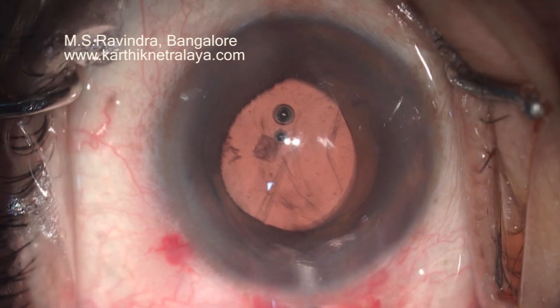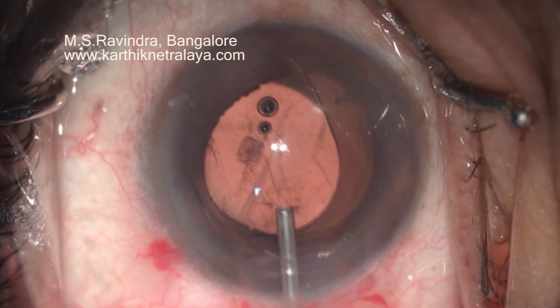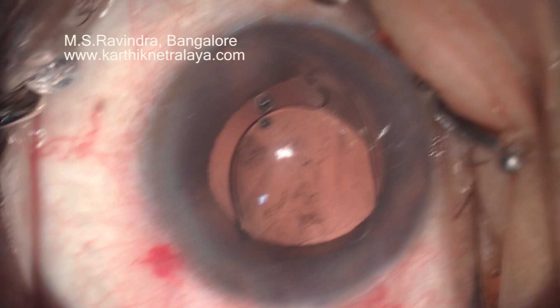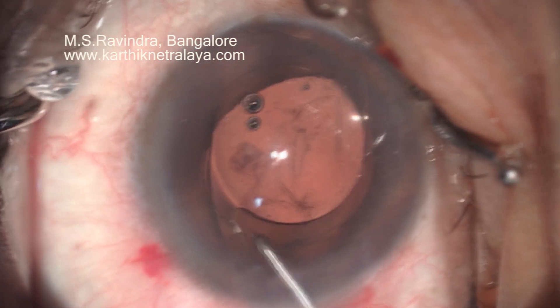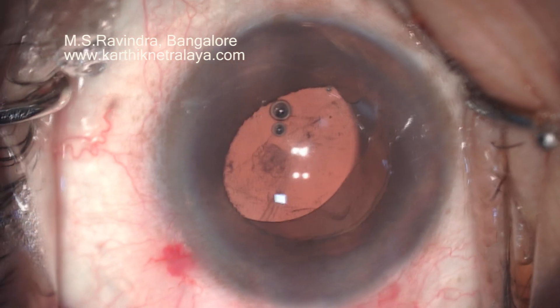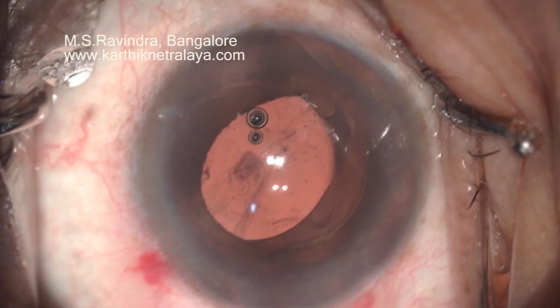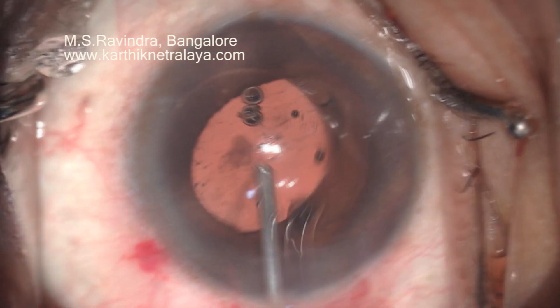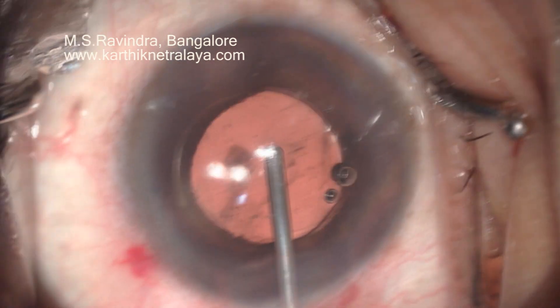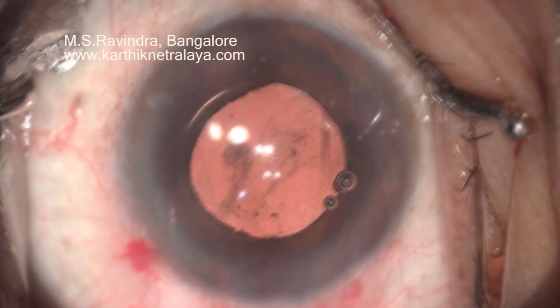Generally, it is a taboo to put the lens in the sulcus, but in my experience, when you have done a good cortical aspiration and everything is neat and clean, the hydrophobic lens is absolutely safe to put in the sulcus. In such special situations, where you would like to conserve the hyaloid space and the pars plana area or the scleral area, this approach is preferred.